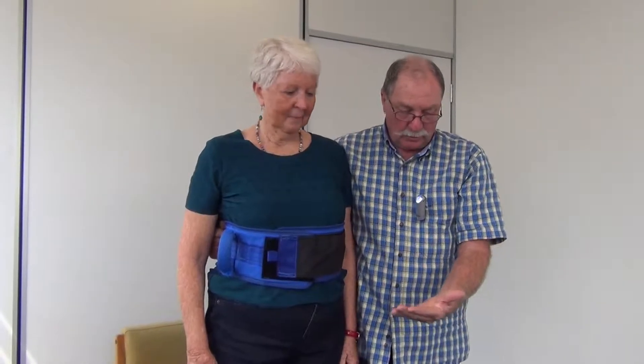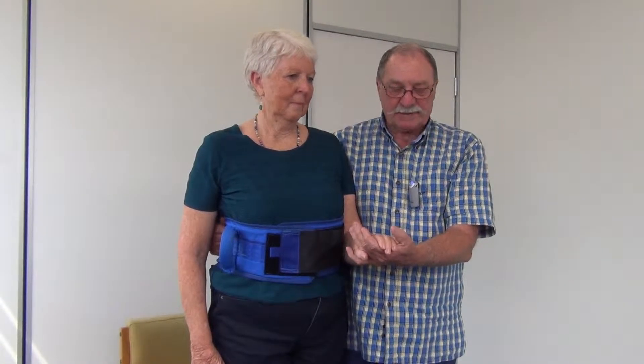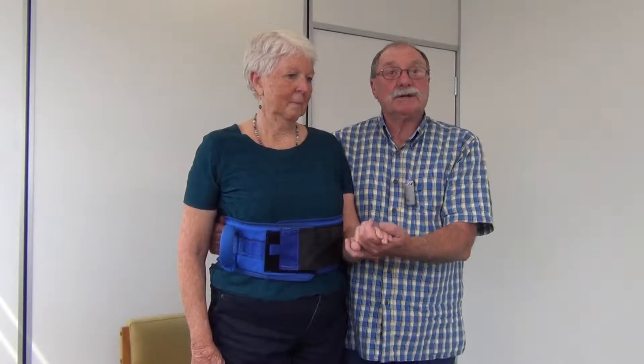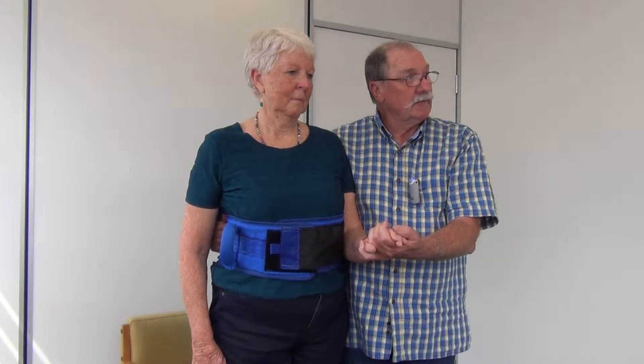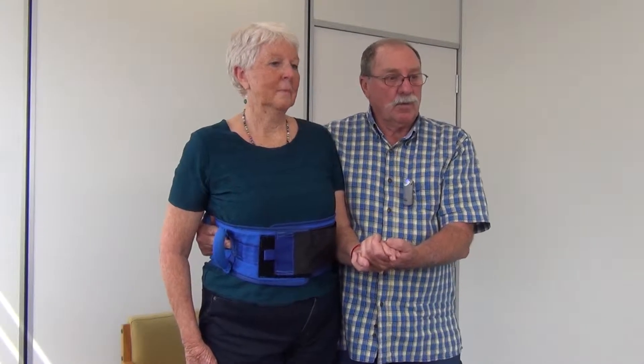If we are going to walk off now, we ask the client to hold my hand. We hold it this way so that it prevents skin tears and bruising. The client is holding my hand more than I am holding theirs. Hip to hip, I am holding firmly and away we go walking.